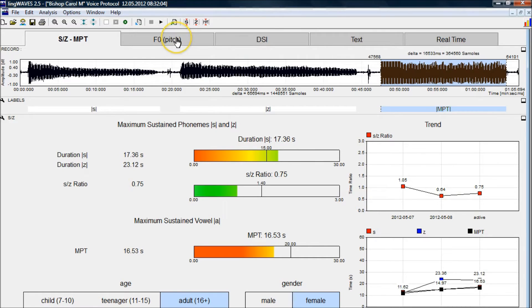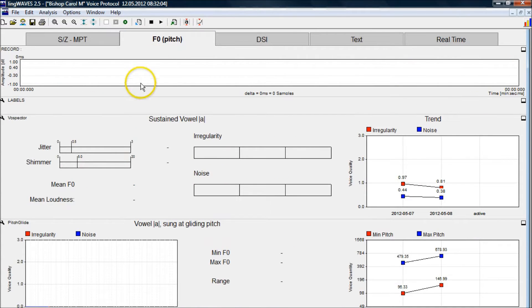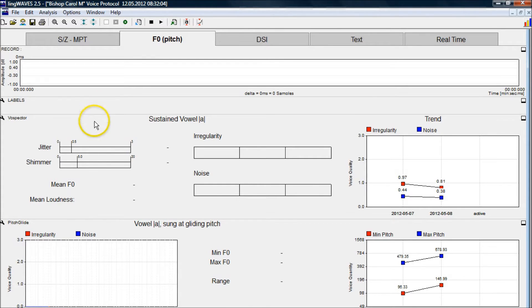The next screen is the pitch screen. On this screen we measure voice quality during a four-second phonation. We also measure pitch range with a glide from the client's lowest pitch to their highest pitch, going up into falsetto or the head voice.